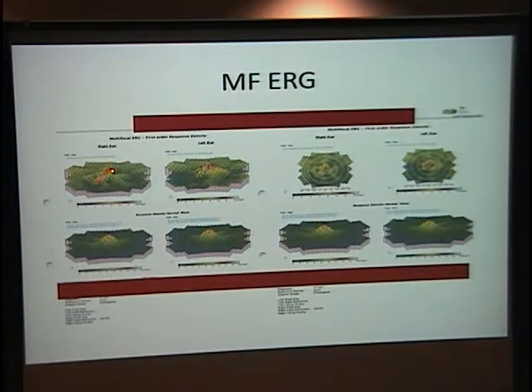On this right eye here, you can see it's not the nice cone peak you would expect to see. That's more consistent with these spots like this, where she probably lost fixation for a little bit. It would give you an appearance like this, not so much that she has lost there. And the left eye, actually the eye that we see more involvement in, looks better, and both eyes look pretty stable. So not much change seen there.